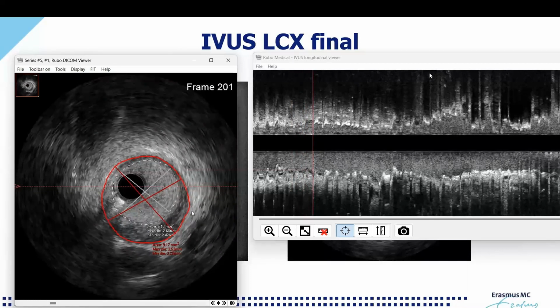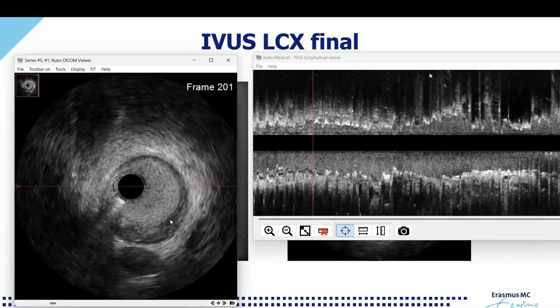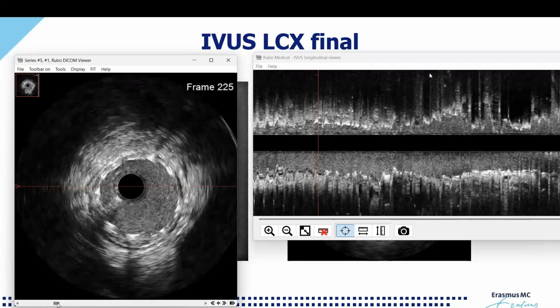And what's nice about this plaque burden of less than 50, it's already calculated and published that if your plaque burden is less than 50%, the lumen size is the original vessel size, because after 50%, the lumen starts to get smaller. So don't bother measuring from media to media for your stent size. Forget that. Go for an area, if you can find that, of less than 50% plaque burden, and then you can safely take the lumen size. As simple as that.